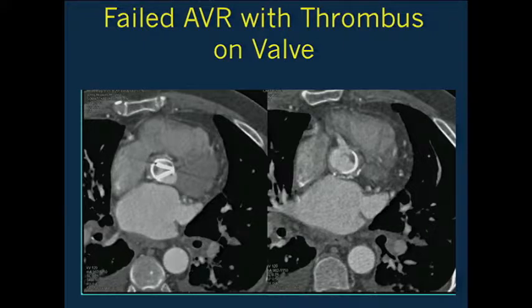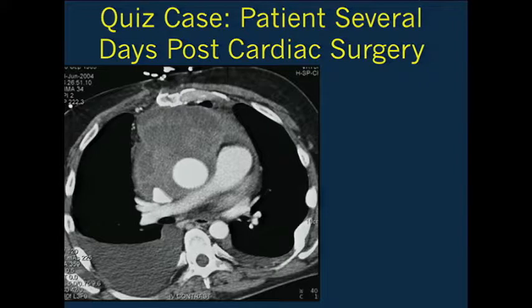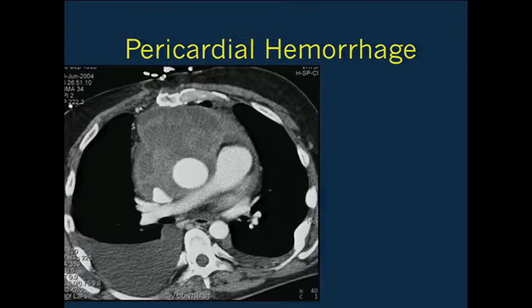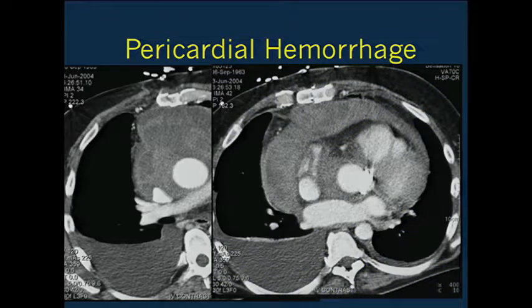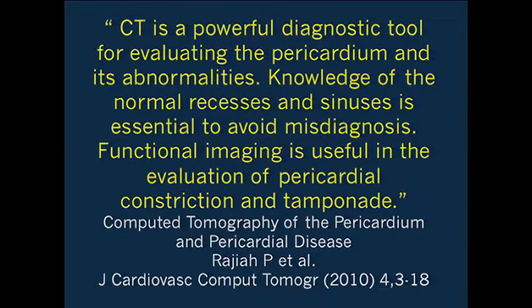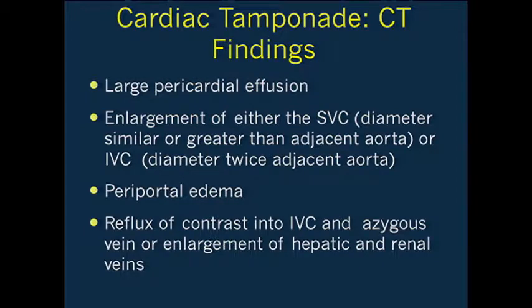A simple case: a patient several days post-op with chest pain and fever, with the thought being mediastinitis. You can see a large collection in the pericardium and also the mediastinum—classically high density, a good example of pericardial hemorrhage. This is often a later complication, though it can occur in the post-op period. Patients on Coumadin are one of the potential risk factors. CT is very good at looking at the pericardium in both native and post-surgical patients. This patient was developing cardiac tamponade—look for large pericardial effusions, enlargement of the SVC or IVC, periportal edema, or reflux of contrast.